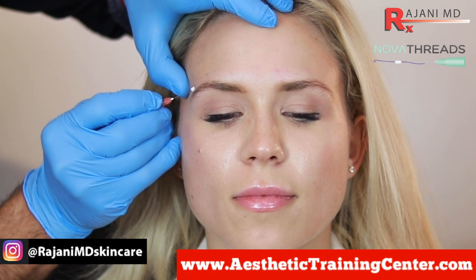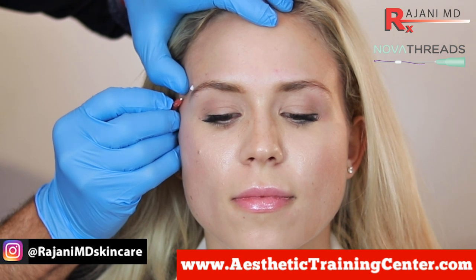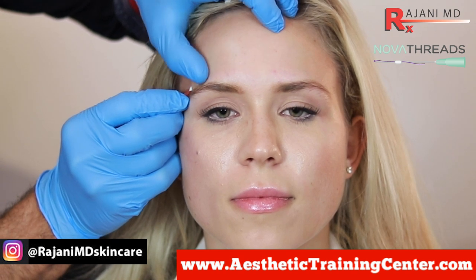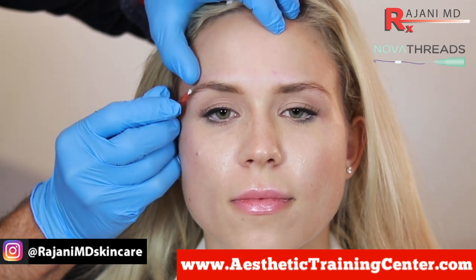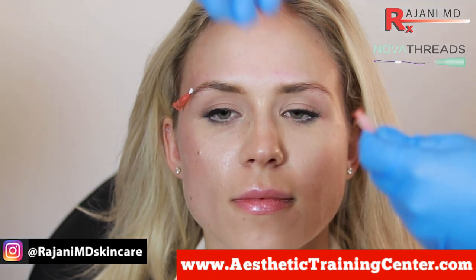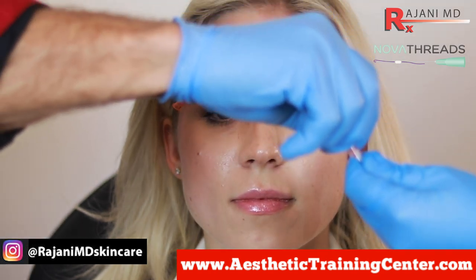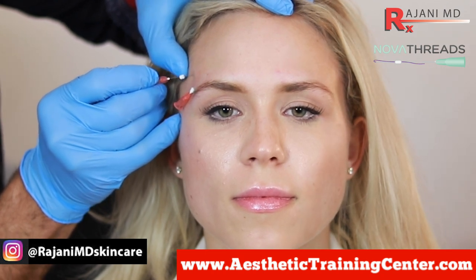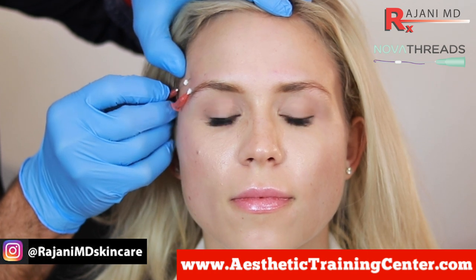So this is a smooth thread I'm using here and the thread enters. One of the things is you don't want to be too deep, but you want to avoid the vessels as best possible. Move the skin toward the thread. You can twist a little bit — some people do. You can leave it in if you want to leave it for hemostasis, then grab the next one. Or if you want to get a nice picture, you can also leave it in. I see a couple of vessels here — that's how I'm picking my zone, and I'll go in between them and go a little bit deeper than that vessel to try and avoid it.